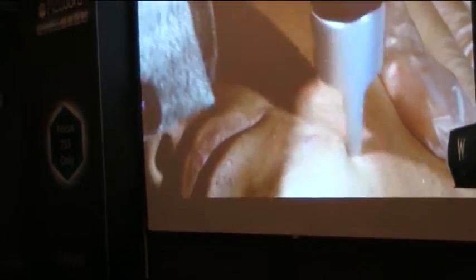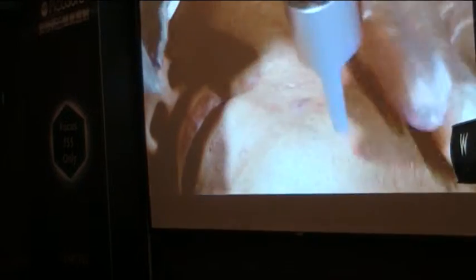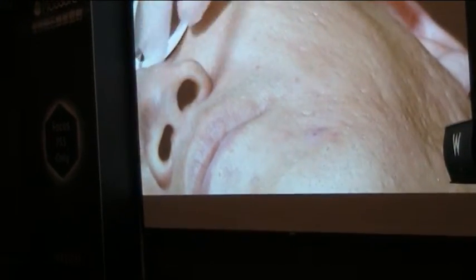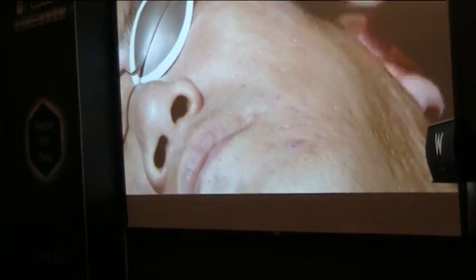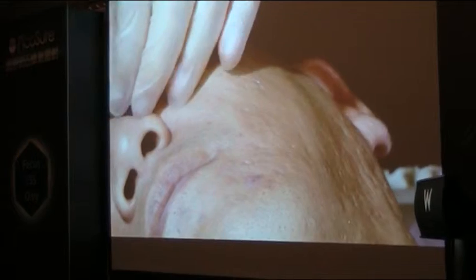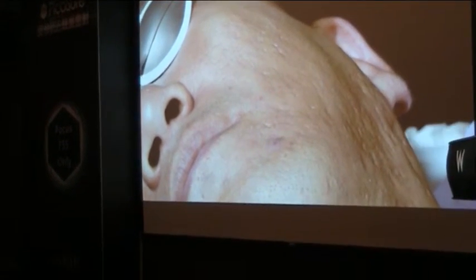This is a very easy way to do the treatment — just keep the distance, keep it focused, and treat the whole area. Even for a skin color like this, you can treat at 6 mm. For most of my patients, we use 6 mm without any problem for this kind of patient.